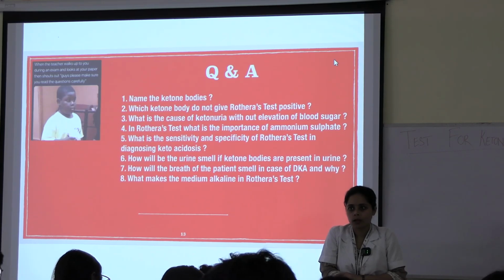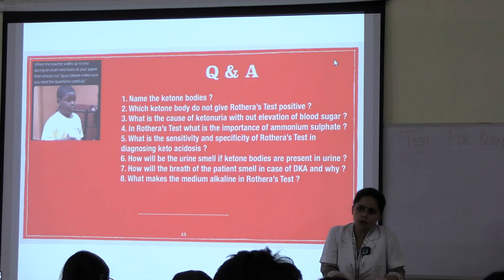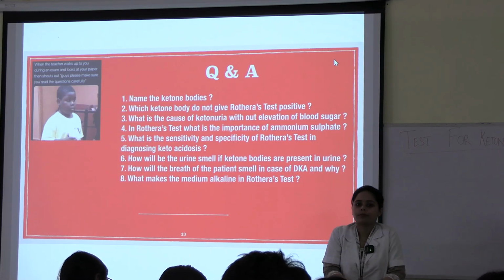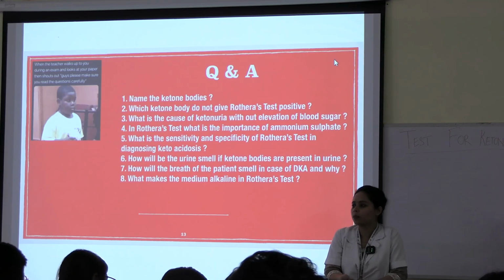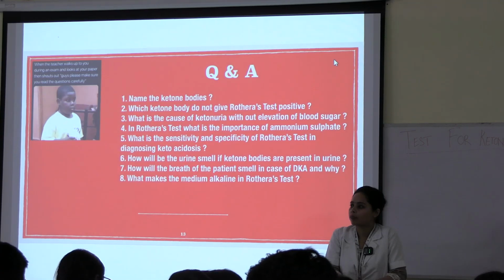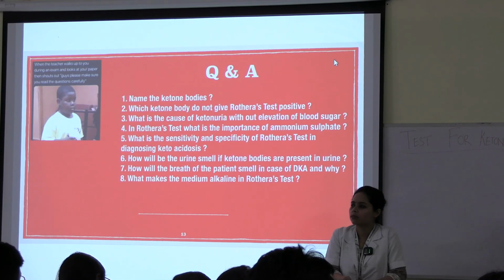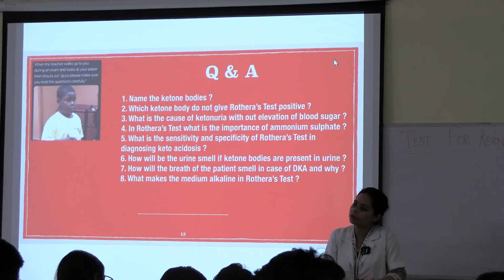Even if the test is negative, ketone bodies may be present in traceable amounts. Now tell me the specificity. It is positive for ketone bodies, not particularly the byproducts.